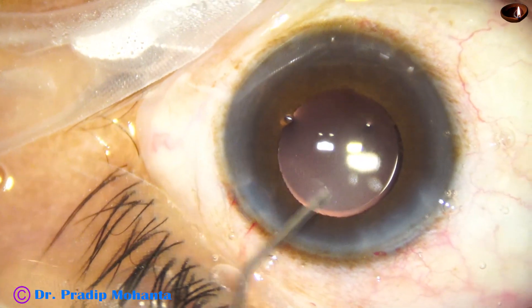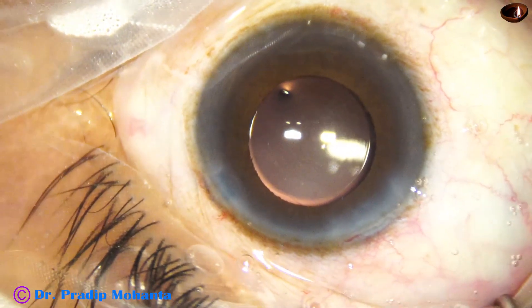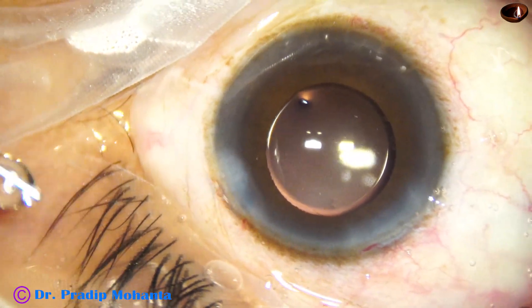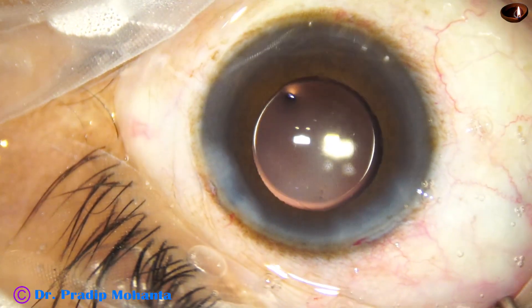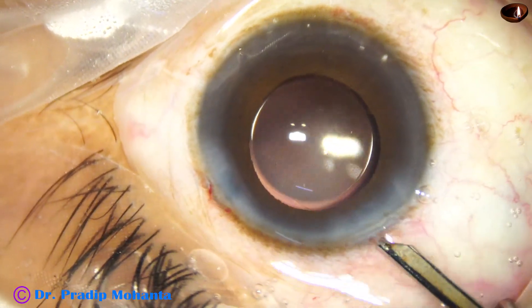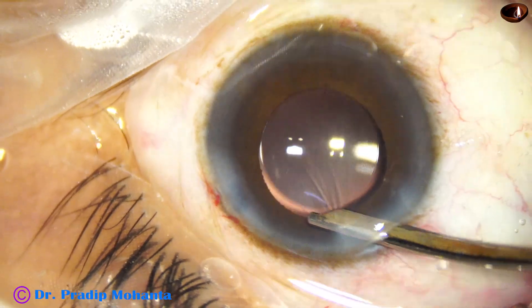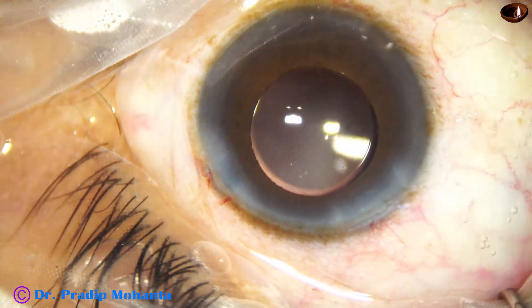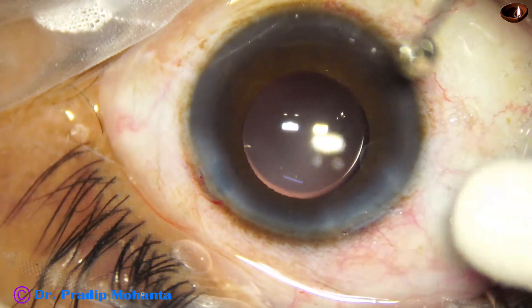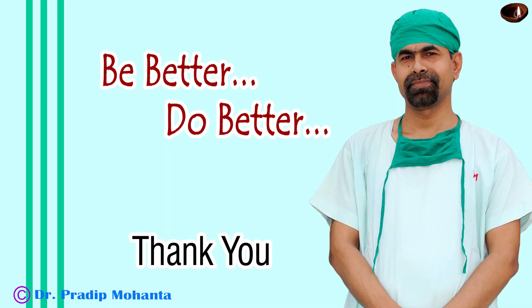Now it is time to close the surgery. Moxifloxacin is applied at this time, and now I close the side ports. A final lavage is done with the Simcoe again — at this time any viscoelastic that sticks to the corneal endothelium comes out. See the wound — there is no wound burn, and the wound is nicely sealed.